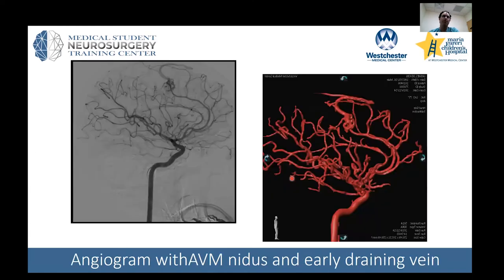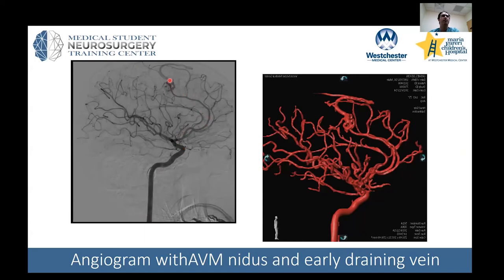The gold standard for this is to perform an angiogram. Angiograms could be a lecture in themselves, but basically you gain access either in the groin or the upper extremities, thread a catheter up through the blood vessels passing through the heart and up towards the brain — in this case, up the internal carotid artery. We can then see here that along the anterior cerebral artery, there is an early draining vein.